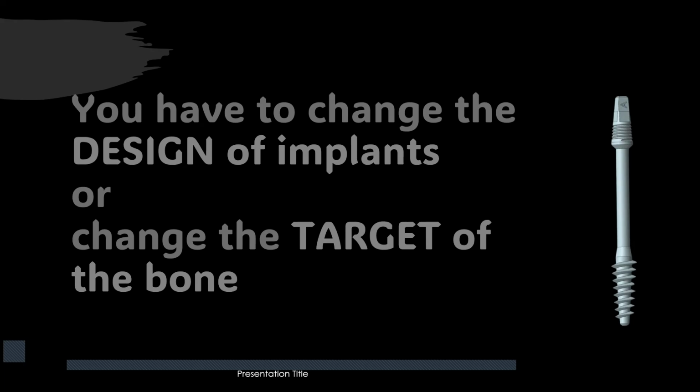Because in my practice, I usually treat patients under dialysis, patients with carotid hemangioma, patients with brain aneurysm, and diabetic patients with HbA1c of 10, 11, 12. We manage all those conditions just by changing the system. And what changed the system? That is the design of the system.